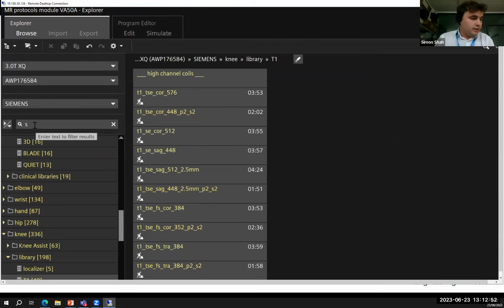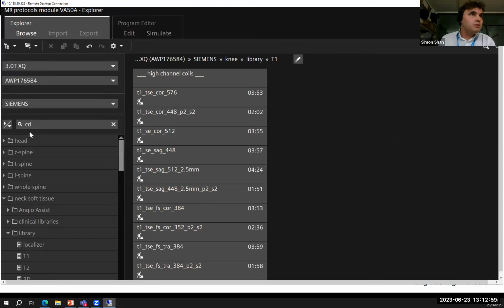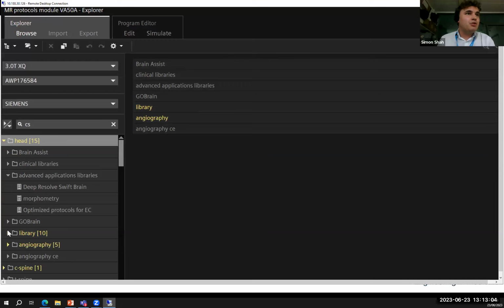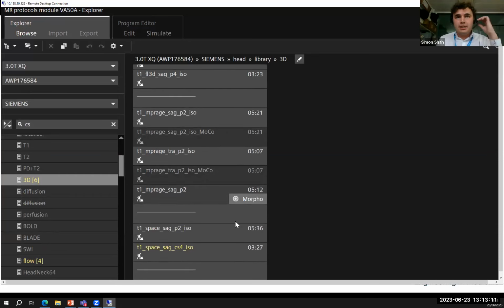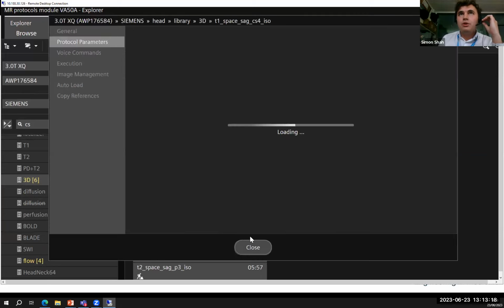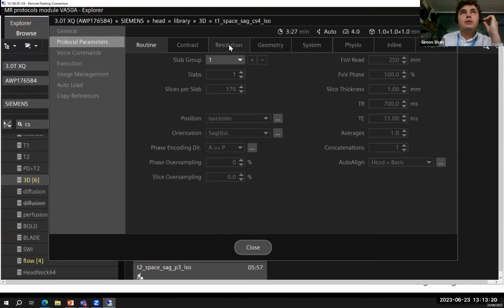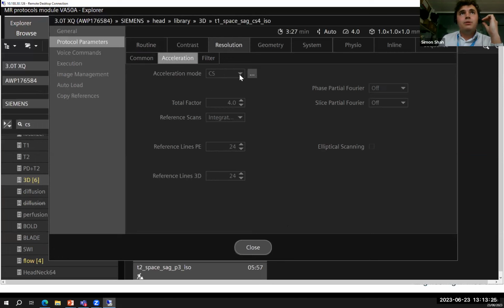simultaneous multi-slice is. If you want to look where compressed sensing is, it's labeled CS, I believe. Not CD though. Again, as I said, these are predominantly in neuroradiology in 3D sequences, and you can find these here. So a bit like the images I showed, this is a conventional T1 with GRAPPA 2. If you use CS4, you've accelerated it by 4 times instead of 2. It is found here. You shorten your sequence.